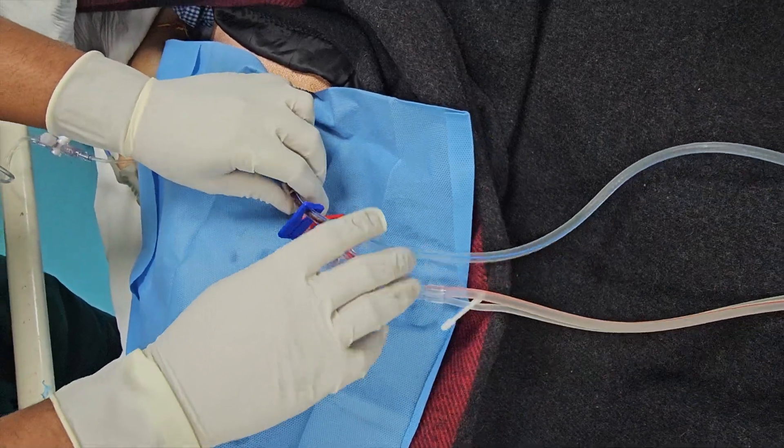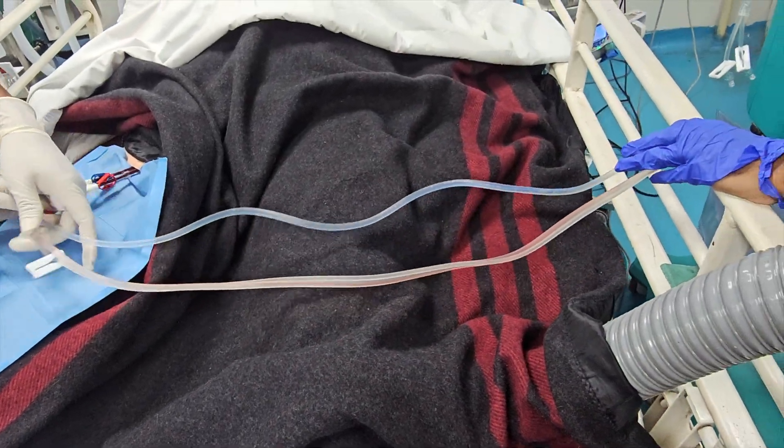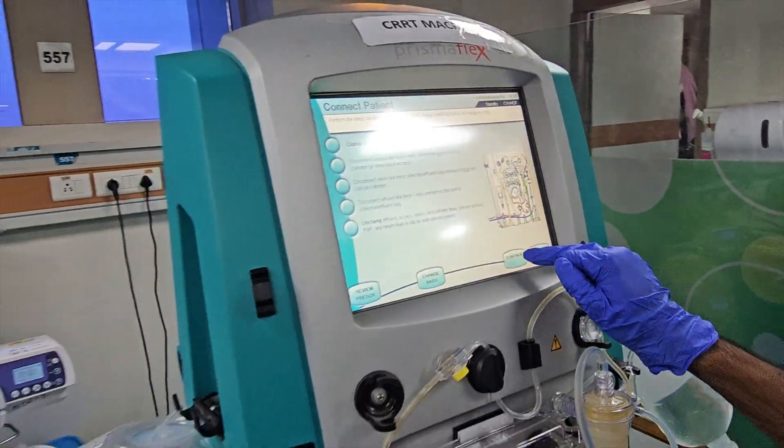Red and blue access lines connected to the patient's dialysis port. Unclamp all lines. CRRT started.